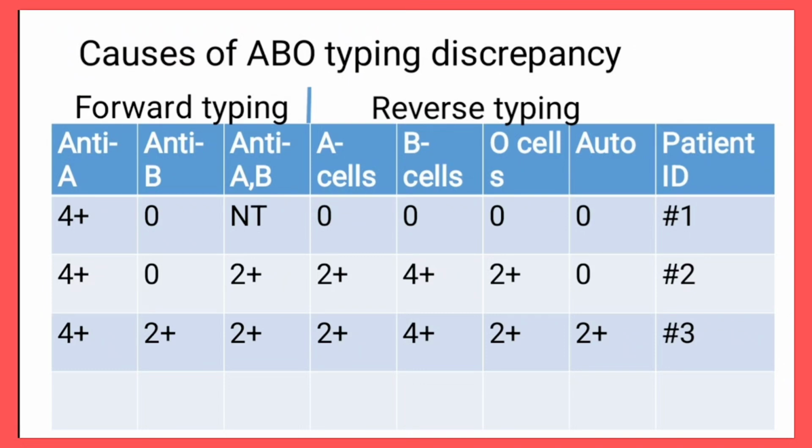But for the purpose of this presentation, this shows that this patient is blood group A. However, there is a problem. Remember that if someone is blood group A, the person should have antibody B. That means the person should have antigen A and antibody B. I'd already explained all of this in my previous video, but just as a quick recap.